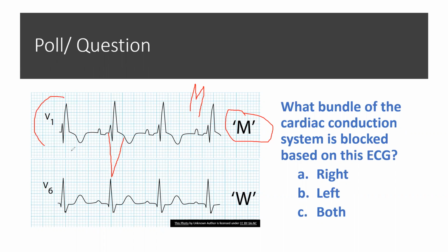Whenever you have a patient that is going to go for an insertion of a pulmonary artery catheter, make sure that there's not a right bundle branch block present or a left bundle branch block present, because these are going to be contraindications for the use of a pulmonary artery catheter.